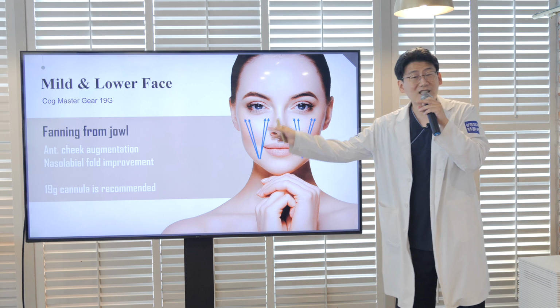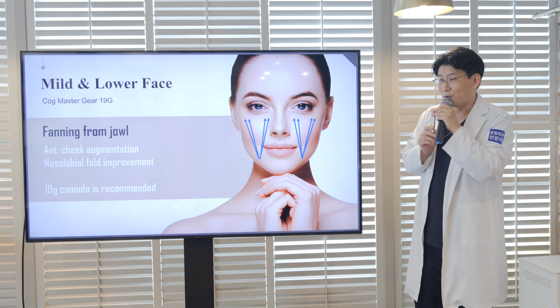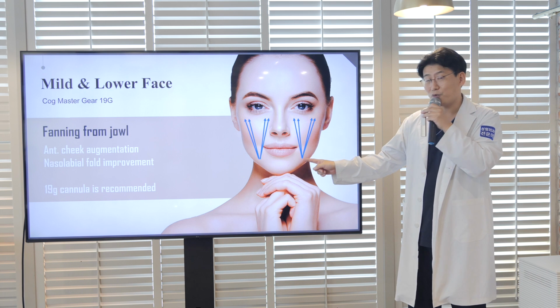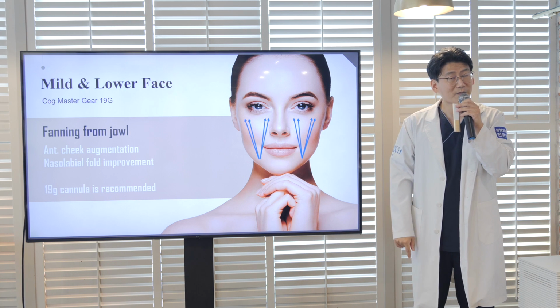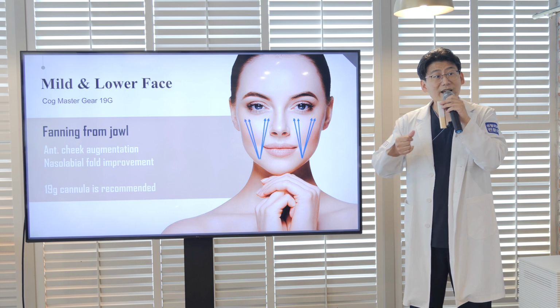The medial correction is also very important. Usually, the jowl and nasolabial fold can be the target area. I can insert 2 threads from the jowl to the medial canthus, another 2 threads from the jowl to the lateral canthus. The dimpling should be released with mild massage.